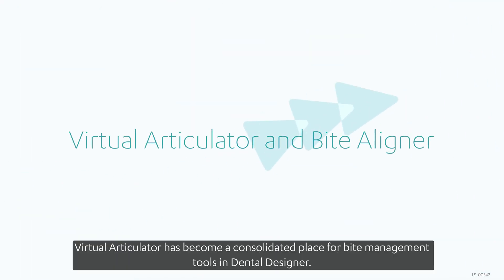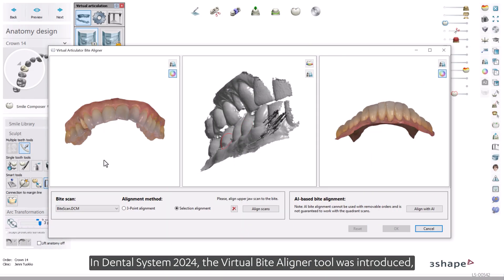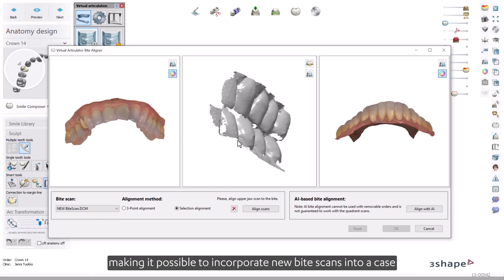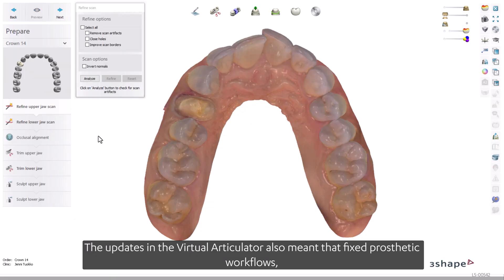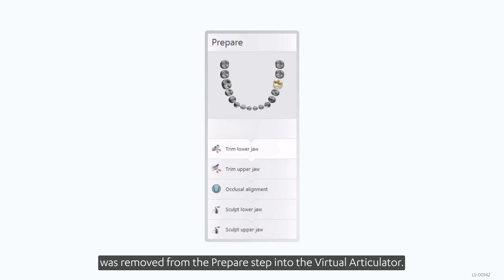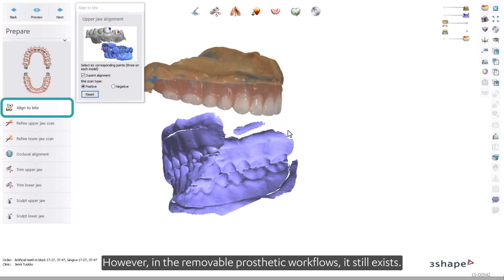Virtual Articulator has become a consolidated place for bite management tools in Dental Designer. In Dental System 2024, the Virtual Bite Aligner tool was introduced, making it possible to incorporate new bite scans into a case and dynamically work with multiple bite registrations. The updates in the Virtual Articulator also meant that fixed prosthetic workflows' Align to Bite sub-step was removed from the Prepare step into the Virtual Articulator. However, in the removable prosthetic workflows, it still exists.